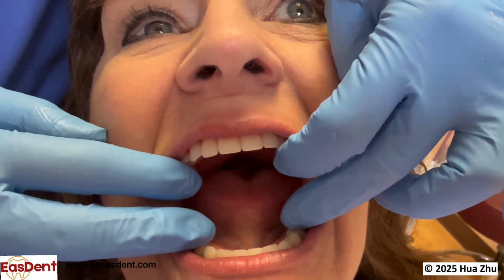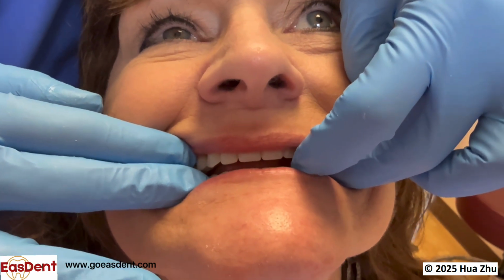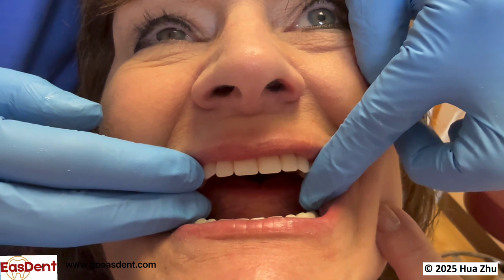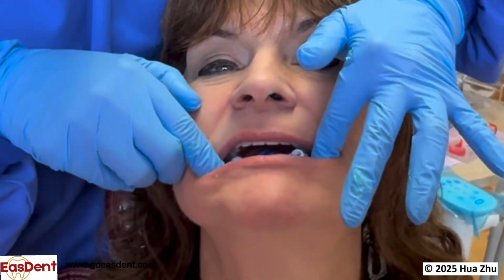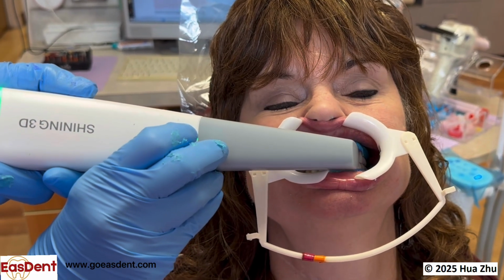If the patient can easily bite into centric relation, you can use that position during the impression stage and scan the upper and lower jaw relationship as centric. If the centric relation does not match the patient's natural or stable bite position, you should record the centric relation using the bite registration material and then scan the upper-lower jaw relationship after impression.